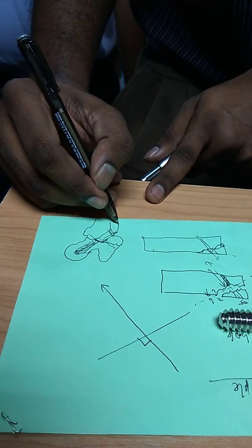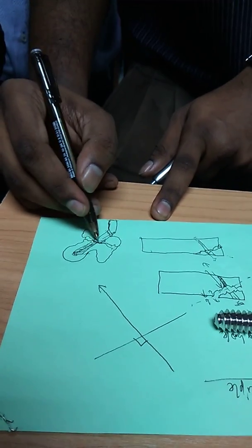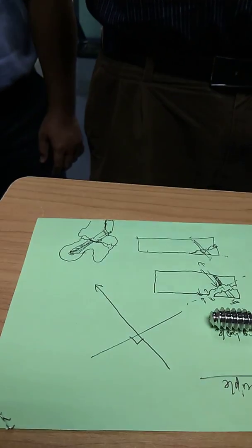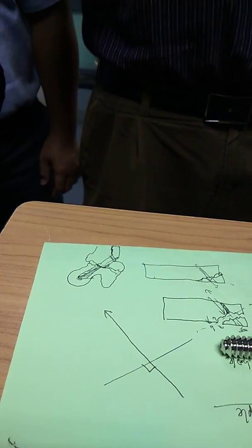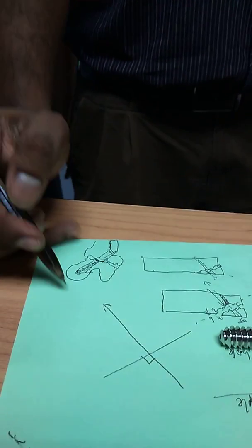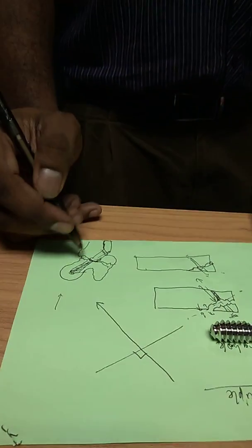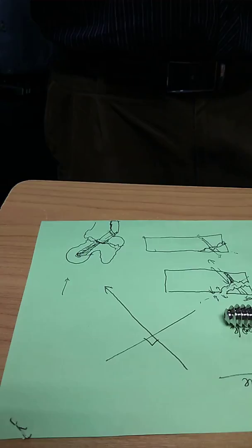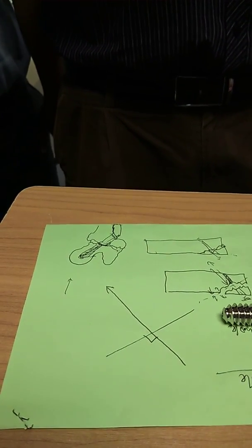Barrel we have to knock it in, and then the plate is here. Okay. So this will create a sliding mechanism at the fracture site to promote healing. So every time the patient partially bears weight, when the body weight goes down, the sliding mechanism occurs at the fracture site, and it will promote healing, controlled collapse mechanism. We call it.